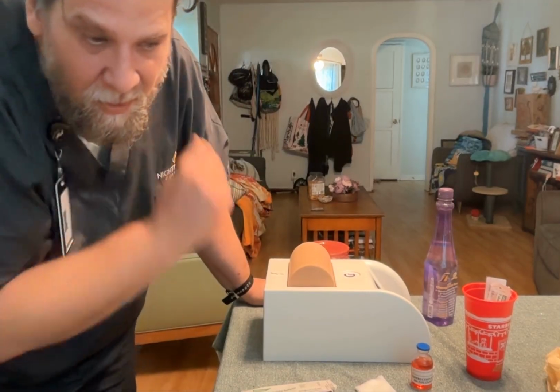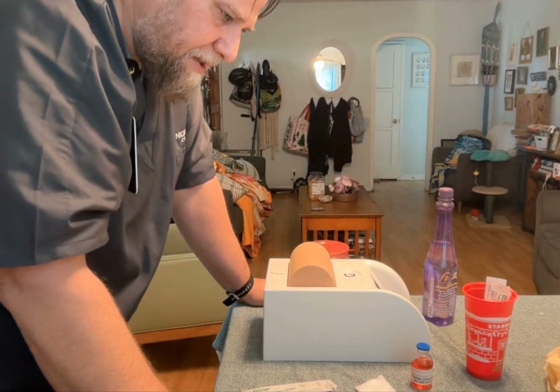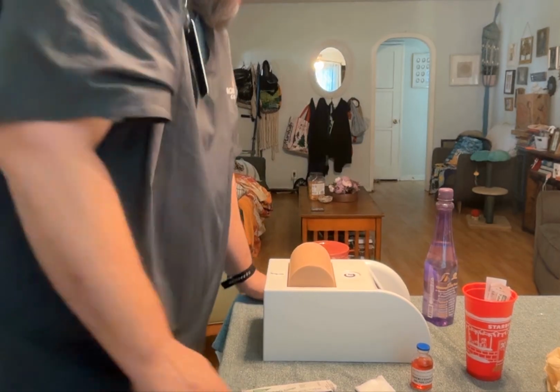Hello, my name is Neil Ward, and I'm going to do a demonstration on subcutaneous medication injections today. First, I'm going to gather my supplies.